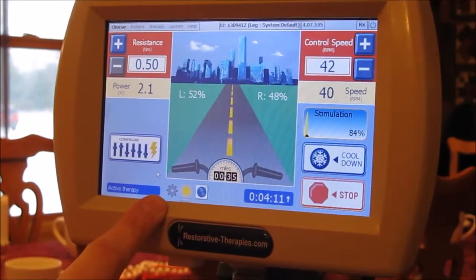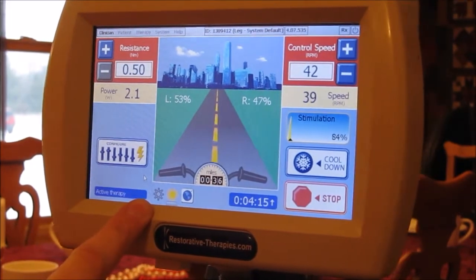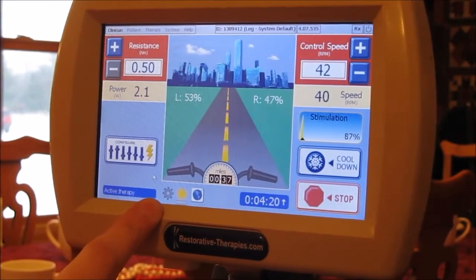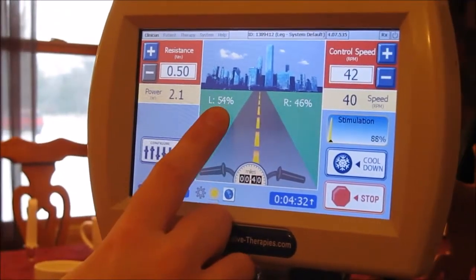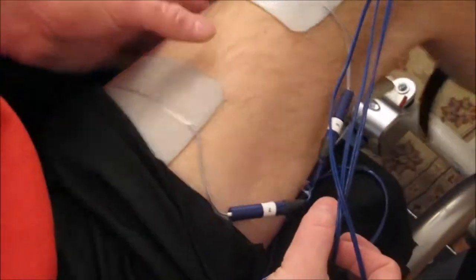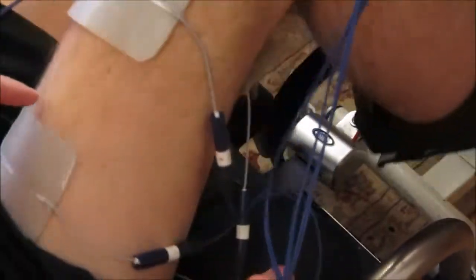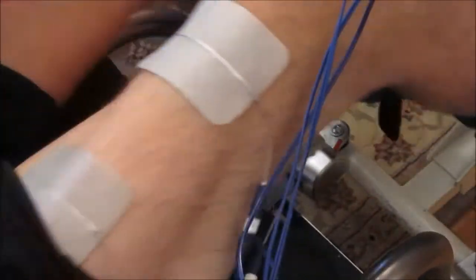If the cogwheel is gray, that means there's enough electrical stimulation going through my legs and my muscles are contracting enough that the machine doesn't have to work — I am working. My left leg is doing about 55% of the work, whereas my right is doing about 45%. You can see a bulge on my leg, and if you could feel it right now, you'd feel that the muscles are contracting. This is a wonderful workout to keep your muscles in shape.